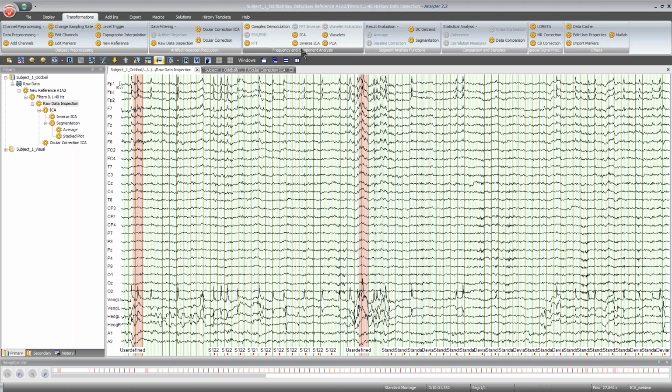Okay. Let's maybe go for two more questions. They are short ones. Is it better to use continuous data or epoch data for an accurate ICA? Basically, it doesn't matter. So in my examples here, I use once continuous data and once epoch data. The important thing is that if you use epoch data, that the epochs contain what you need. So if you want to remove blinks and in your epoch data there are only 3 blinks, then you might not be able to run ICA properly on that.